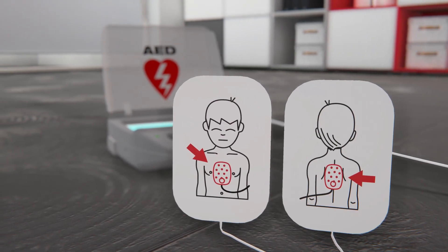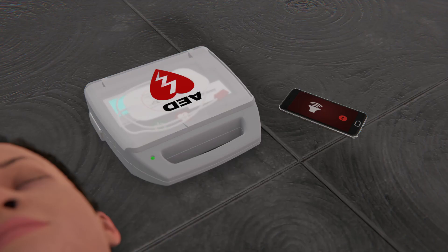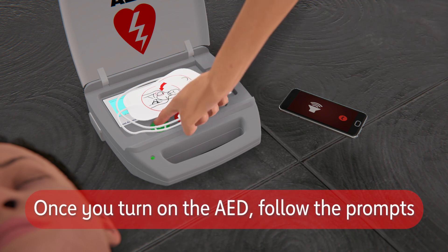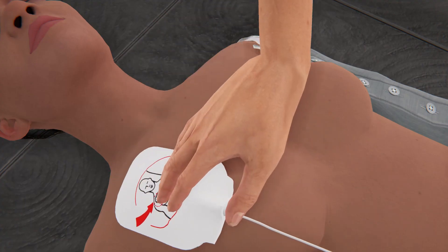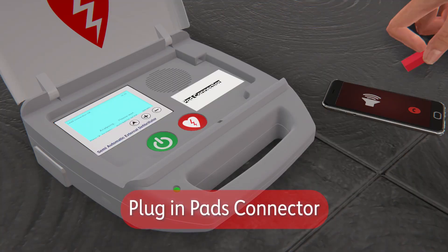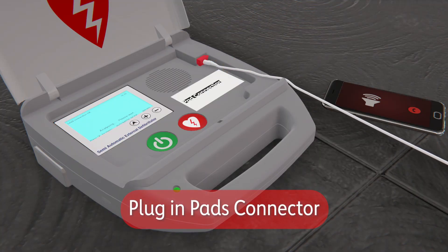AEDs may have two sets of pads. Ensure you use adult pads on anyone who has shown signs of puberty or older. Turn the AED on and follow the prompts, which will tell you everything you need to do. Peel away the backing from the pads and ensure there is nothing between the pad and the person's bare skin. Plug the pads connector into the AED if necessary.